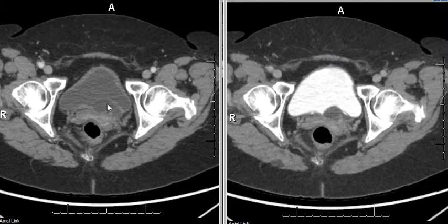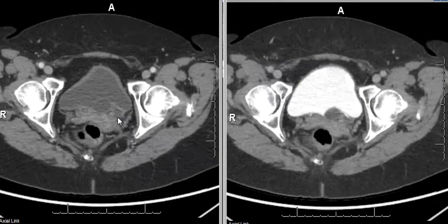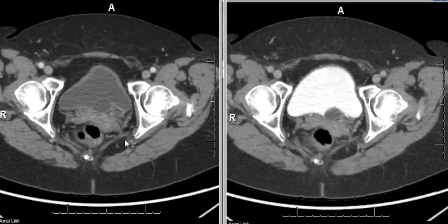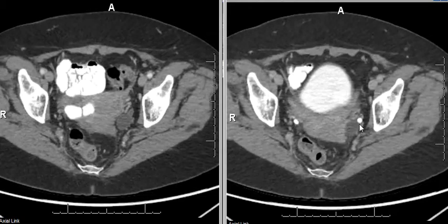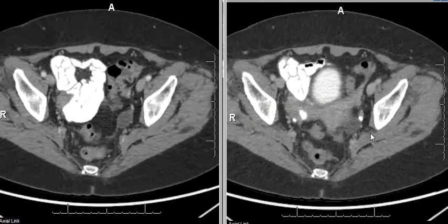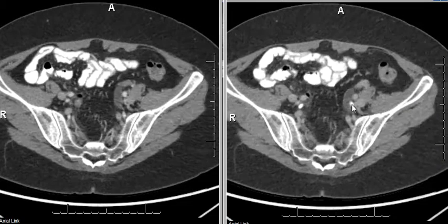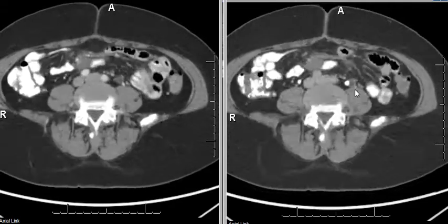You can see this on the contrast enhanced scan on the left and also on the excretory phase scan as a filling defect. 80% of the ureteroceles arise in the duplex system as seen in this patient. You can see there is a duplicated ureter and the obstructed ureter drains into the ureterocele.